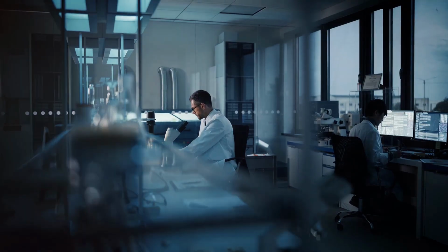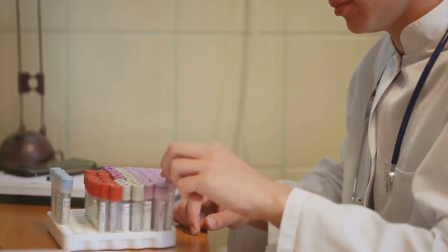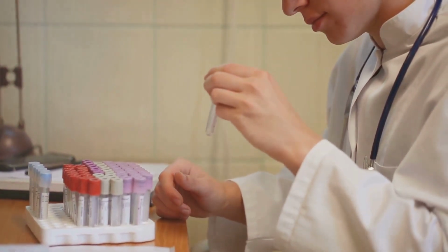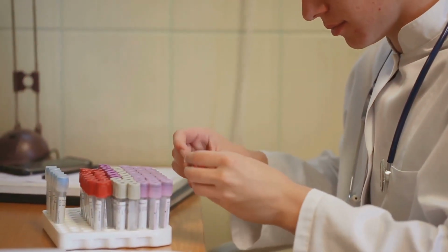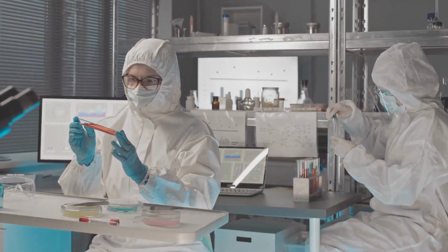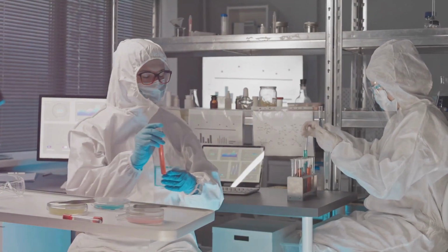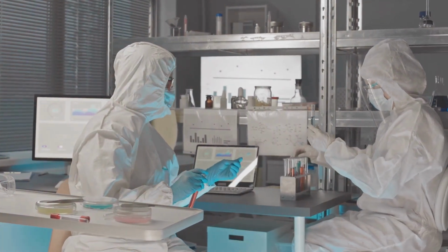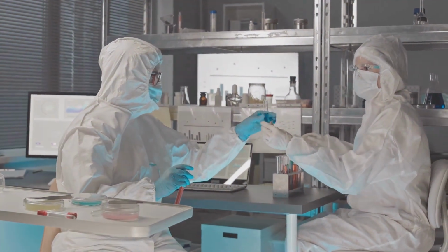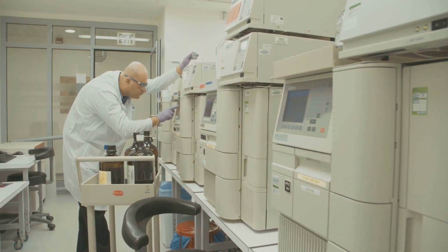Section 7, Clause 6, Sample Receipt, ensuring a smooth transition. Upon arrival at the laboratory, samples must be received and processed efficiently to minimize any potential for error or degradation. This initial step is crucial for maintaining the integrity of the samples. ISO 20658 outlines clear procedures for handling samples upon receipt, ensuring that every sample is treated with the utmost care and precision.